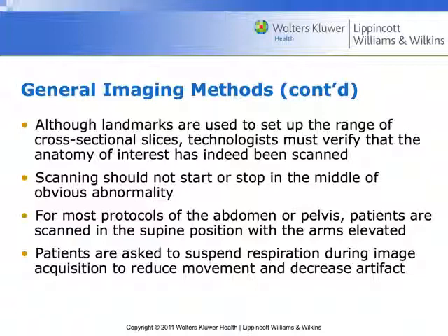And if the technologist overlooks or changes patient position but forgets to indicate that in the scanning protocol, that can definitely cause some problems. Also, just being aware of where you're zeroing to. It may be helpful to zero to like the xiphoid process and then begin the scan like 10 centimeters above that or something like that. You just want to make sure that you include everything from the diaphragm, generally through the pubic symphysis.